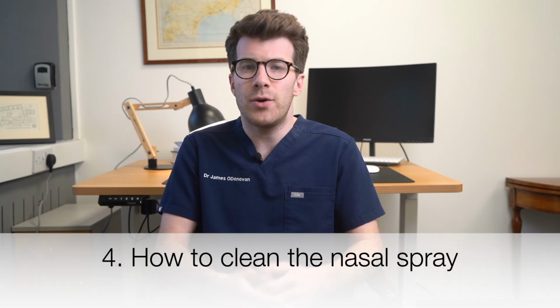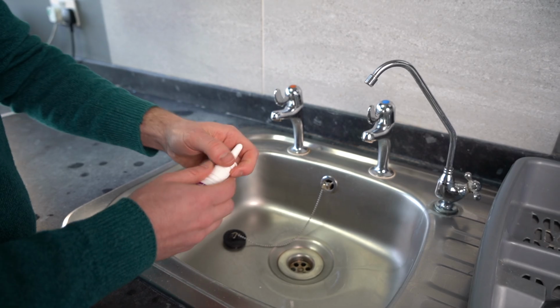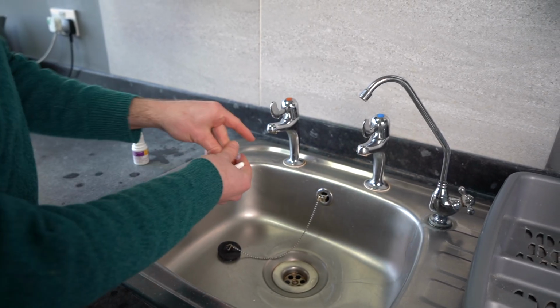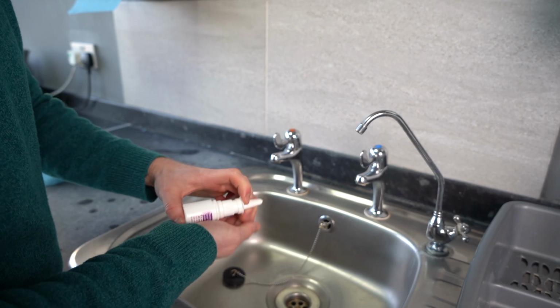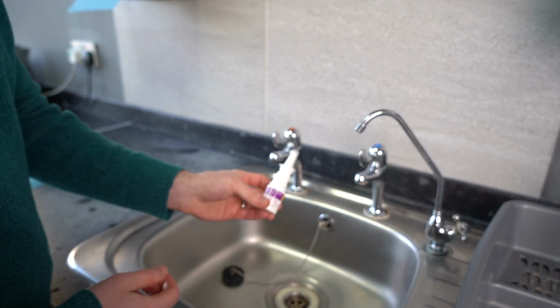So how do you clean your nasal spray? Well, it's important that you clean your nasal spray regularly, otherwise it might not work properly. To do this, remove the dust cap and gently pull off the nozzle. Wash the nozzle and dust cap in warm water and rinse it under a running tap. Allow them then to air dry. Once they're dry, push the nozzle back onto the bottle and replace the dust cap. In terms of storing this medication, it's important that once opened, the bottle should be used within 2 months and you should store it in a dry and cool place.